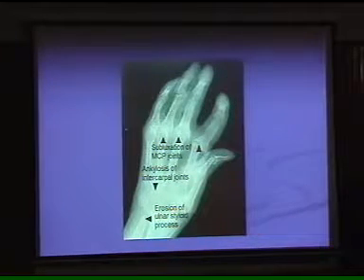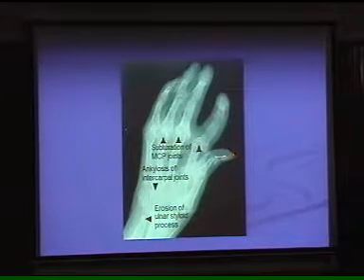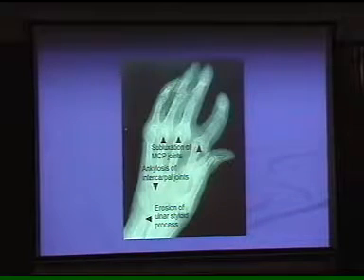Sometimes, if the disease is more aggressive, you look at this ulnar styloid process, that becomes totally eroded over there. You can't appreciate that. And look at the joint space; they're becoming narrowed, and there are deformities.